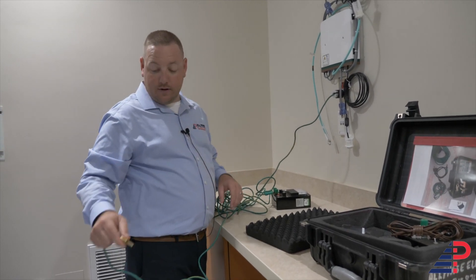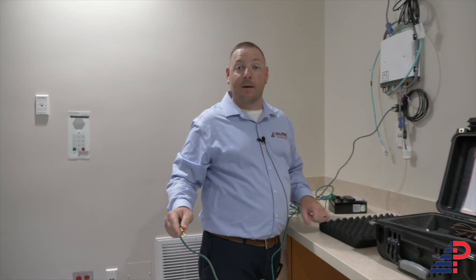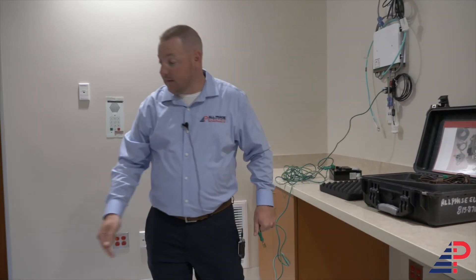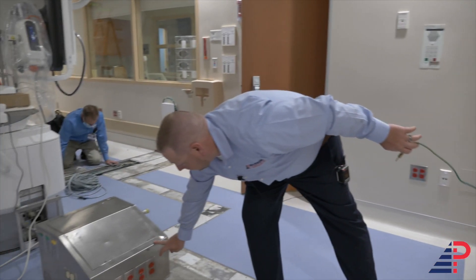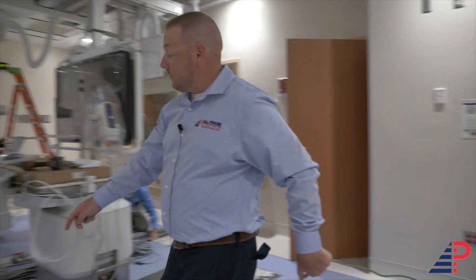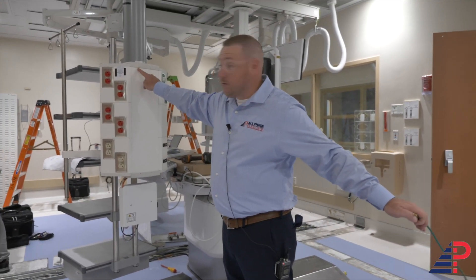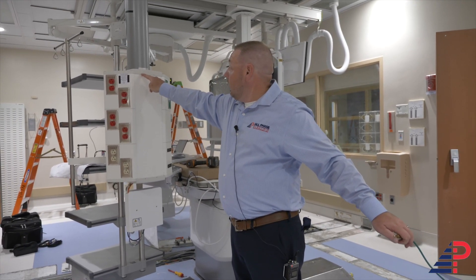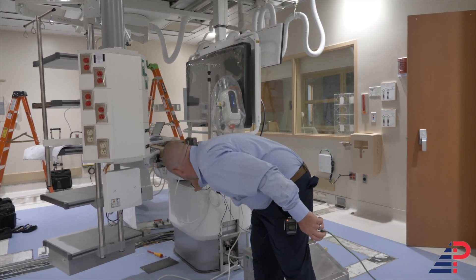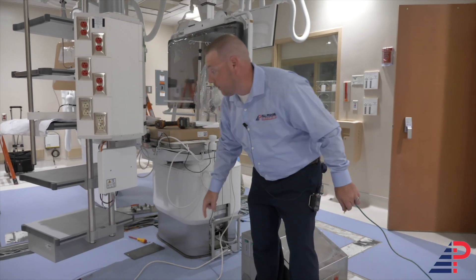Next, take your long lead and go around and start testing anything likely to become energized — anything metal. Like right here on this pedestal, touch the other receptacles. We're not going to touch the critical because critical is already tied together, but we'll touch the normal receptacles, the metal screws on the pedestal, the metal screws underneath the bed, the bed itself, and the floor duct. Test all of that and find your highest reading.